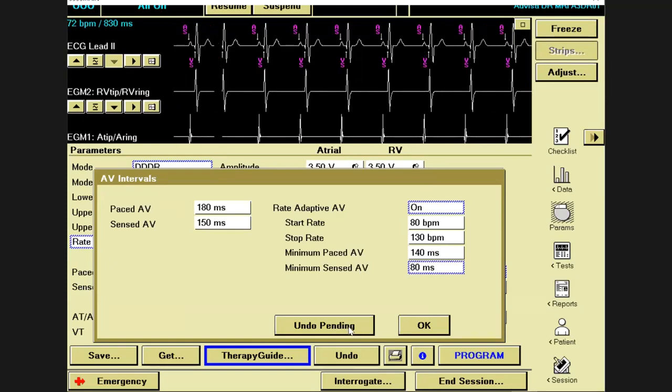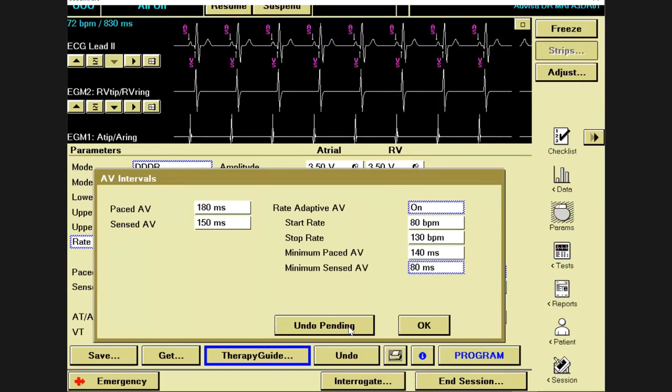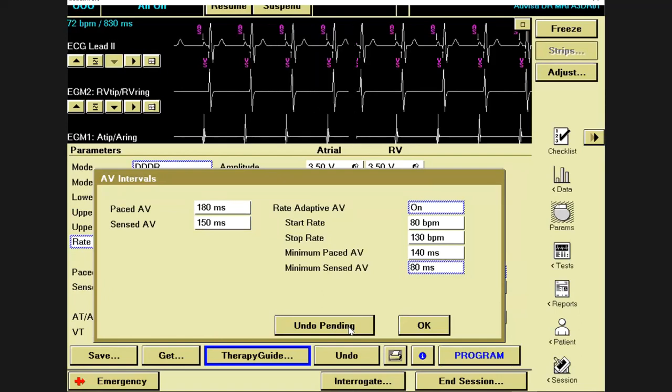Thank you, Govindo. Right. So these are programmed based on the patient in front of you. A little bit of interaction might happen, which is okay, and will not make a significant difference clinically for your patient. So either way is okay.